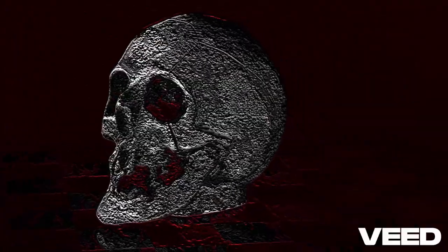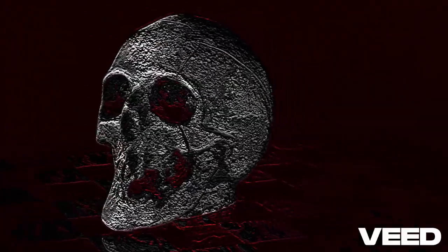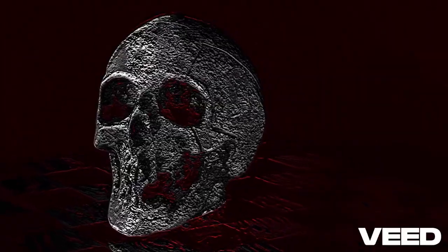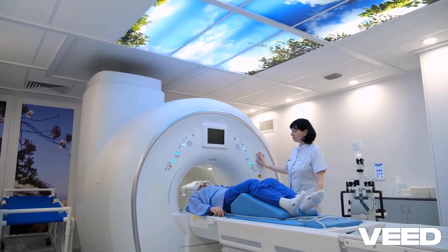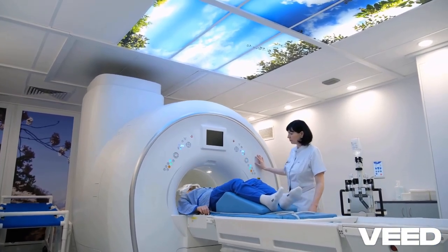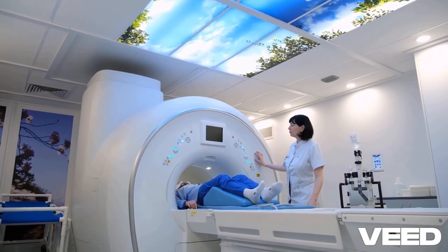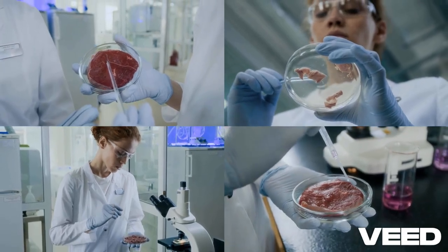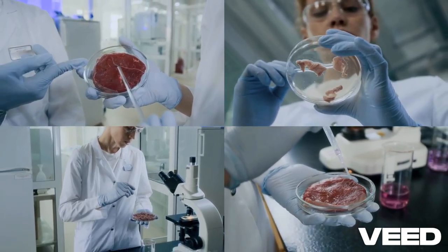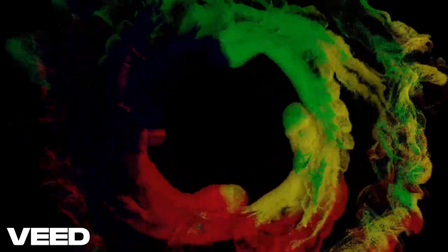However, the future of PET is bright. Scientists are developing new tracers that target specific tumor types, like those detecting low-oxygen regions or certain proteins. Time-of-flight PET is improving resolution and cutting scan times. Artificial intelligence is being used to enhance image interpretation and catch patterns doctors might miss.